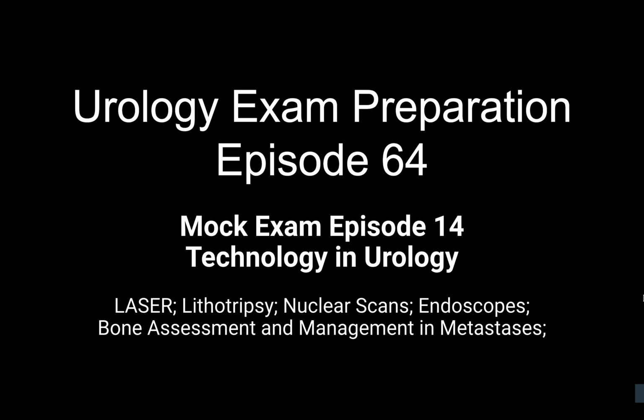How does this DMSA scan differ from, say, a MAG3 renogram? DMSA scan is a static radionuclide imaging, while MAG3 is a dynamic scan. DMSA scan is basically to assess the state of the renal tubules, area of scarring, area of inflammation, but it doesn't tell us if there's any obstruction, whereas MAG3 can tell us the area of obstruction.